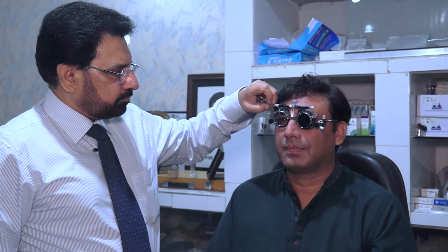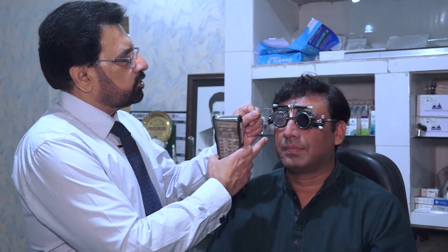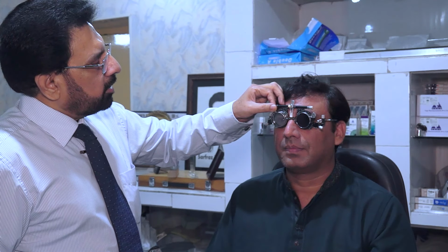Yeah. Okay. So, we're going to now put the other lens. We're going to change the lens now. Okay. Now, is this one better or the previous one is better?